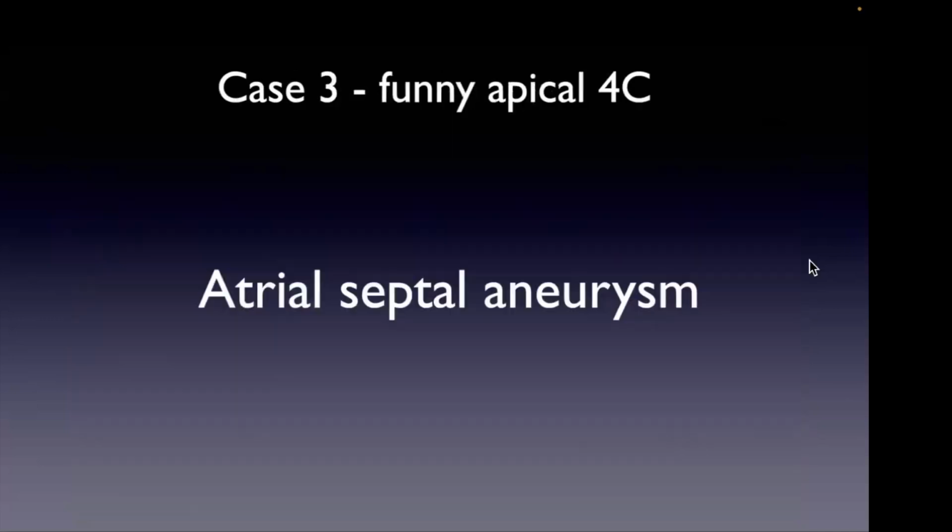Sorry, excuse me. Can I ask a question? Sure. When we deal with atrial septal aneurysm or a mobile atrial septum, do we automatically do a bubble study? I think sometimes we do, but I don't think we necessarily have to, unless it's a question being asked. It's not part of our protocol as far as I know. Okay, so we have to just check with you every time. Yeah, it's always useful to check with the reader. You're right. Readers might have different preferences.